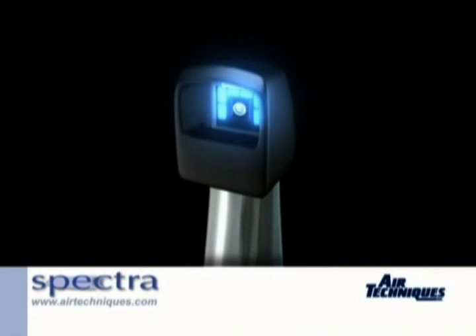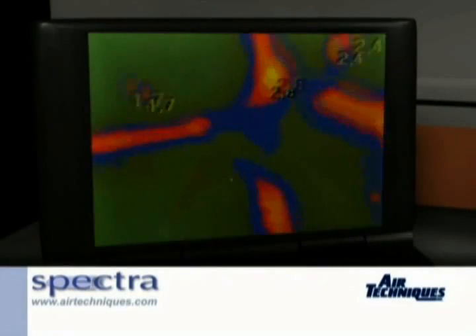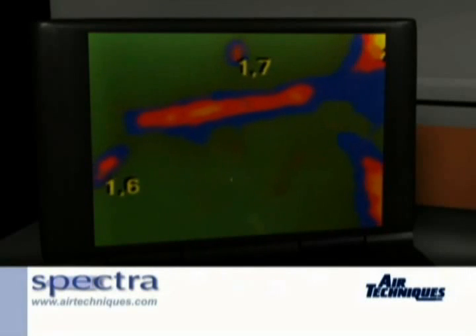Air Techniques' Visix imaging software then interpolates the image and highlights caries lesions in different colors on a numeric scale of 0 to 5, depending on the severity of the decay.